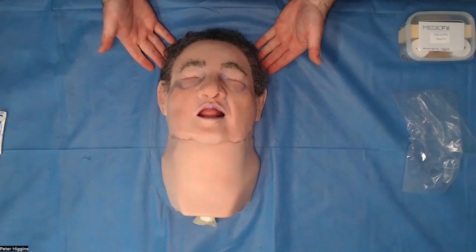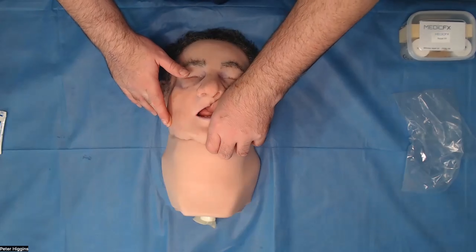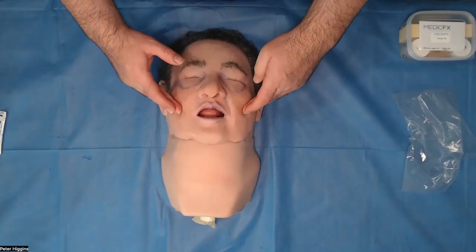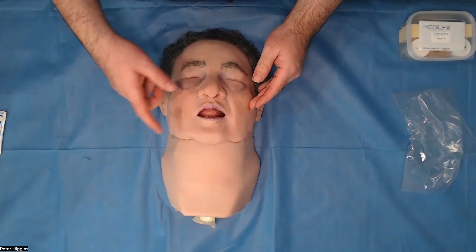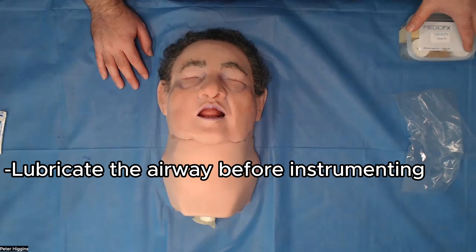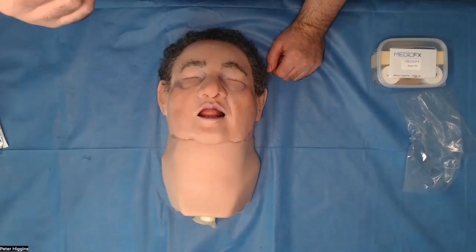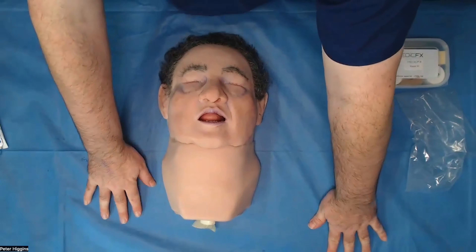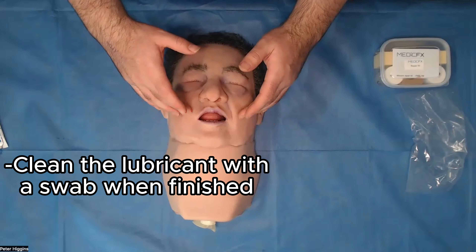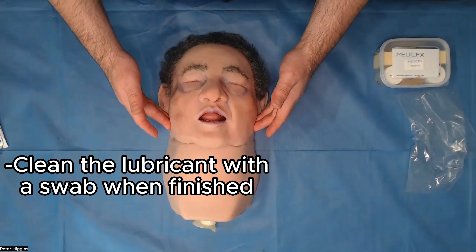So that's the setup of Conan — he's all ready to go now. There is one more thing I would suggest: if your participants are going to be making attempts at instrumenting the airway, just lubricate the airway a little bit with a water-based lubricant. The standard water-based lubrication that you would normally use for an airway is fine. Just at the end, make sure that you clean out the oral cavity with a swab and try and get it as dry as possible.